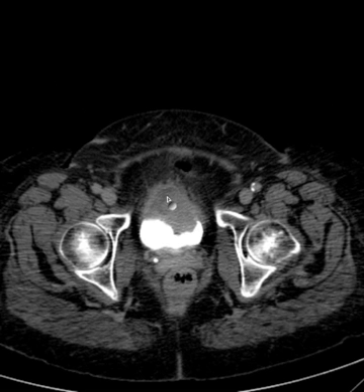What would this be? Well, this is a soft tissue mass anteriorly in the urinary bladder creating a filling defect, and that suggests a bladder tumor.